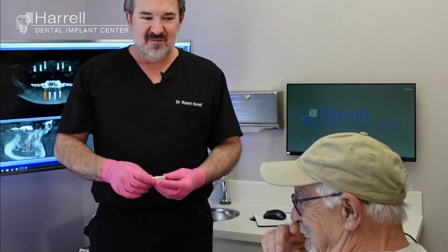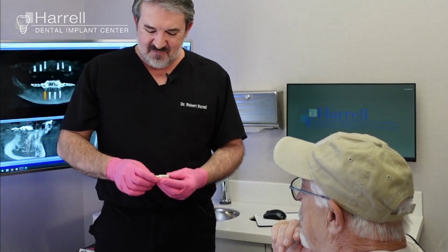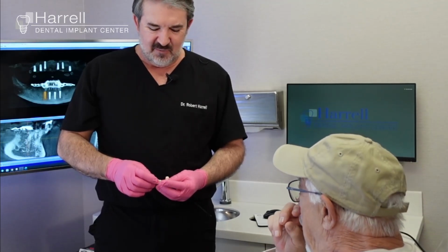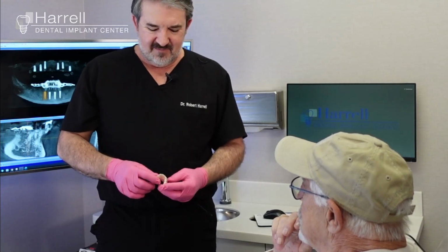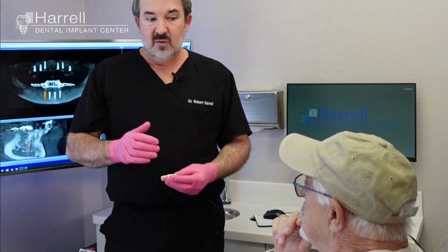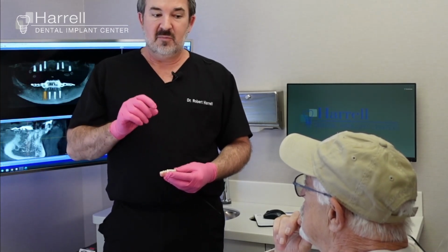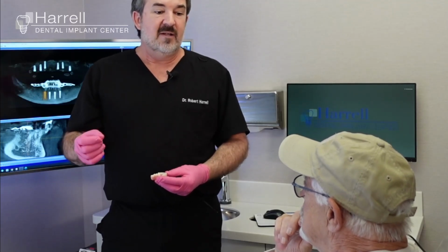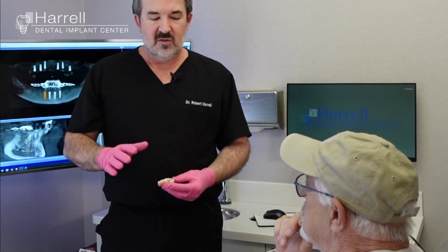It's a little risky to put some Loctite on it, but I've had somebody ask me to do it, and I did. Well, I don't think I'd get that far. It works. I think I trust the way I've been doing this for a long, long time. Yeah. And you get a recipe for how things work, and when you use high quality parts, when you know that the manufacturer specs on these screws are what they're supposed to be, and not, oh, I've got some cheapo screw that really doesn't thread in correctly, it makes a huge difference.